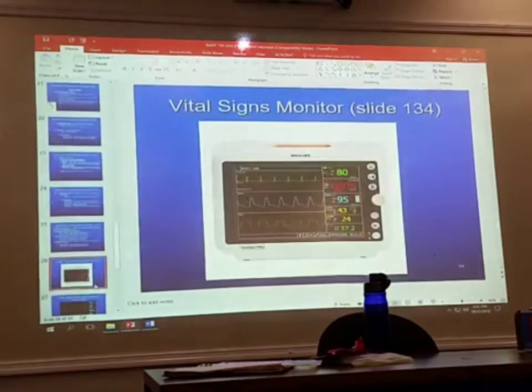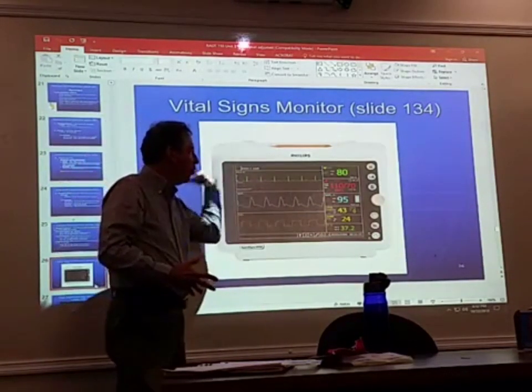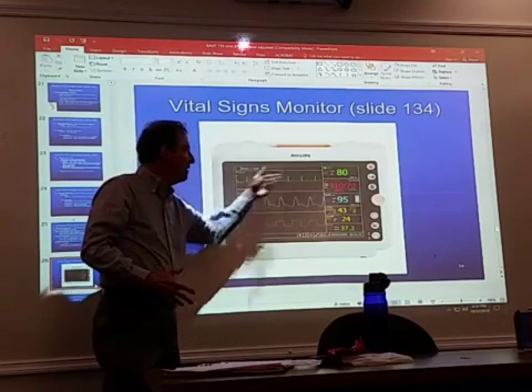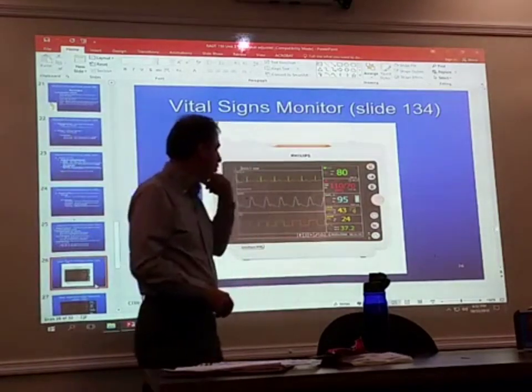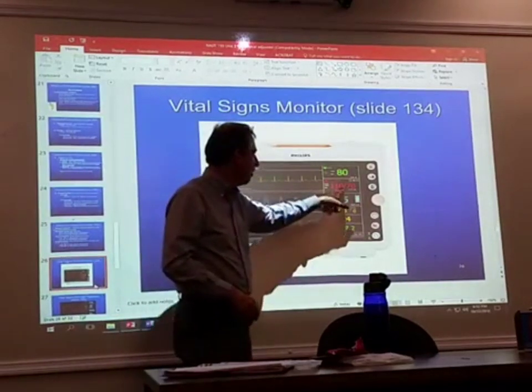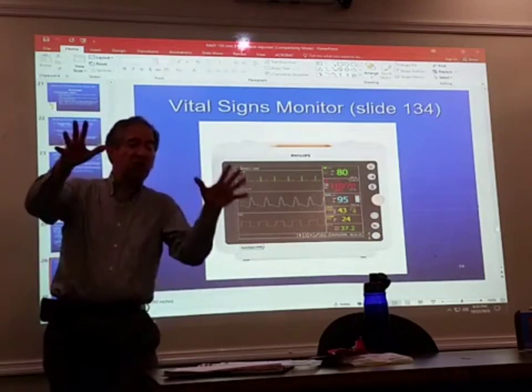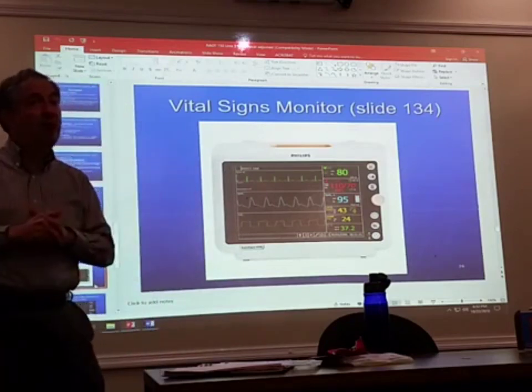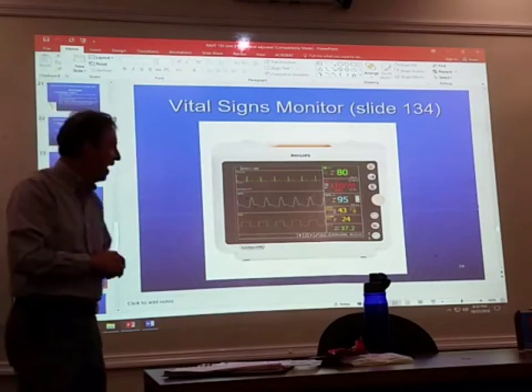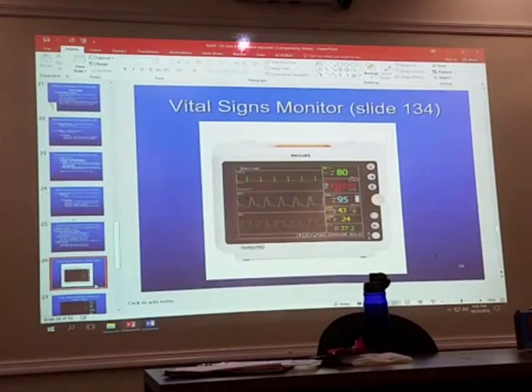So just kind of wanted to show you on that. Now you'll be able to look a little bit better at some of the monitors, and you can see, like you go to a patient's room, you want to sit the patient up, you can look at the blood pressure and say, oh boy, that's low, maybe I need to check. You always want to check anyway before you sit them up, but if it's low, it'd be like, oh, this would not be a good candidate to sit up, okay?